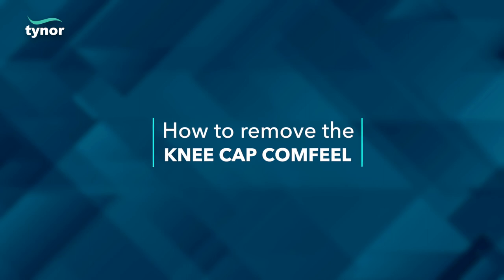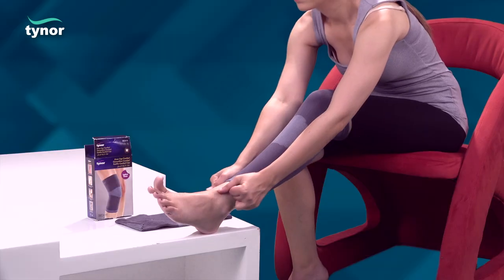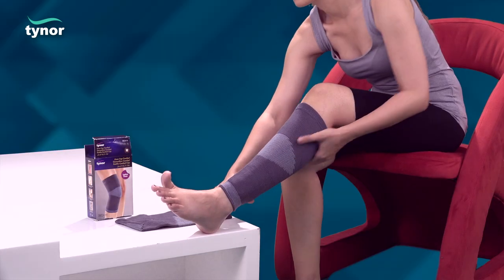Now, let us see how to remove the Kneecap Comfuel. The product can be simply pulled down for easy removal.